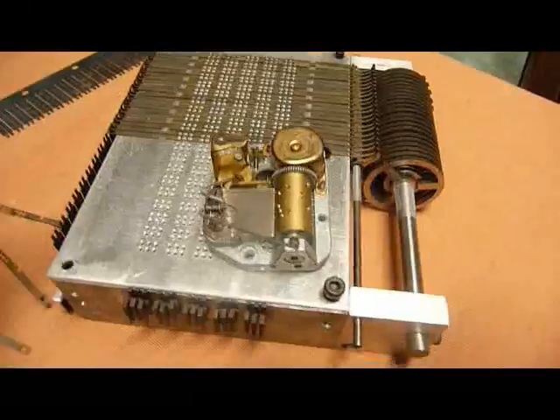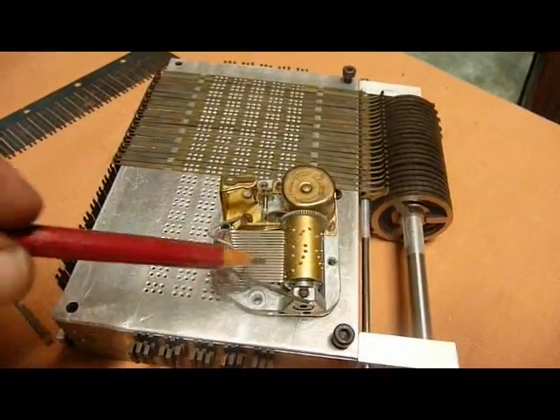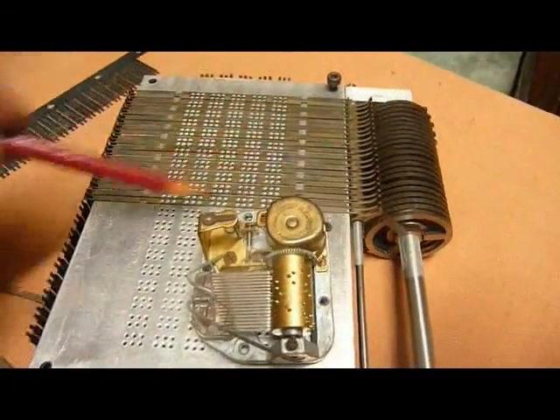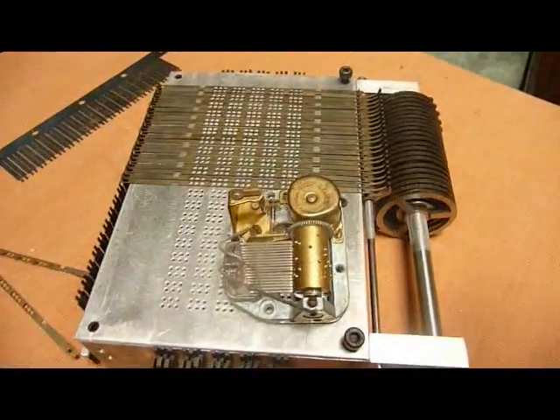This musical movement has a bank of cams over here toggling a comb spring. In this example, we've got a bank of cams over here toggling the locking and unlocking slides in the sequence that we want. Here it's musical, over there it's sequential.